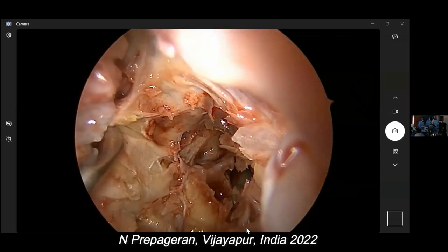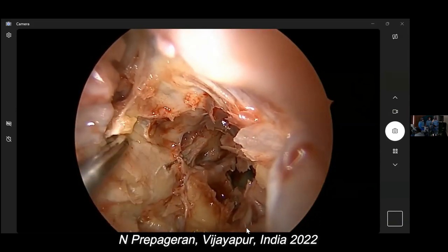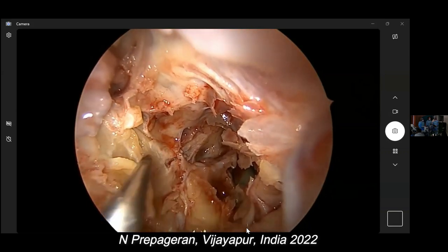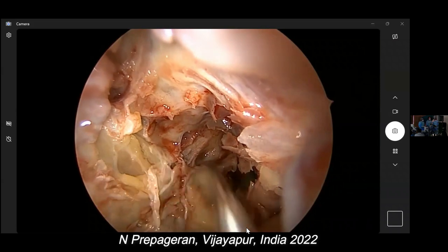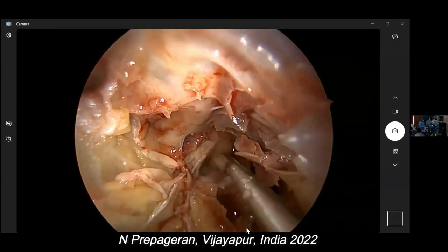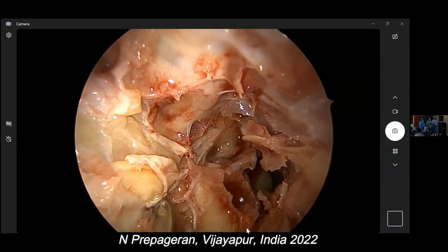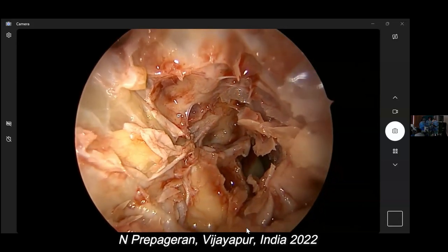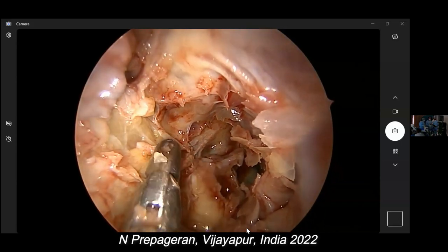So I'm going to cut this, my normal lazy way. We'll name this flap after Shashi Kumar. Shashi Kumar's flap. Okay. So now we have removed the big slip. We have removed the periorbita over the orbit.